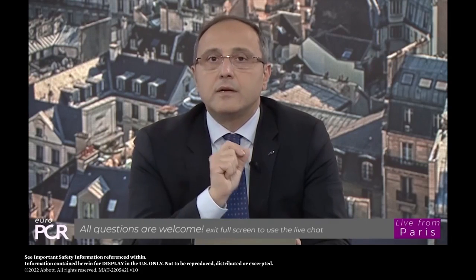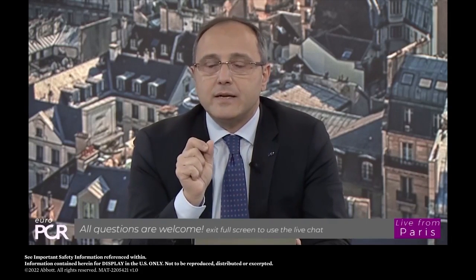So in that case, when we have a stenosis and FFR is below 0.8, what PPG is telling us on top is whether we can help these patients by implanting a stent, because we are dealing with focal atherosclerotic disease, and that is the case when PPG is above 0.5. At the variance with a PPG below 0.5, that is practically informing us that we are dealing with a diffuse coronary atherosclerotic disease. And in that second case, even if we implant a stent, it's very unlikely that with a segmental treatment, we can improve much the functional result of that particular PCI.